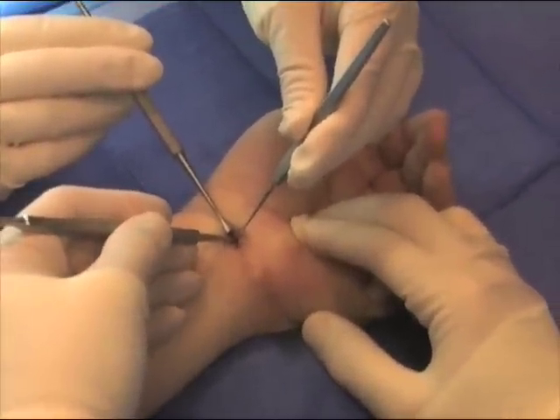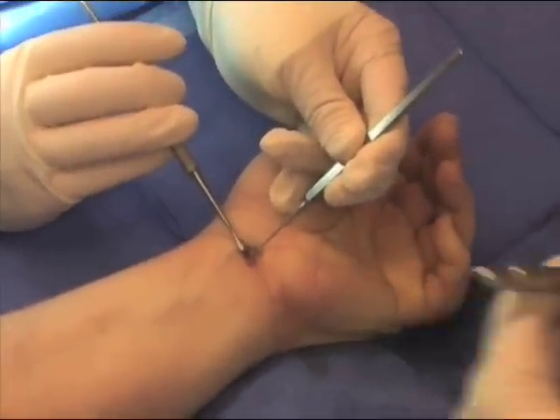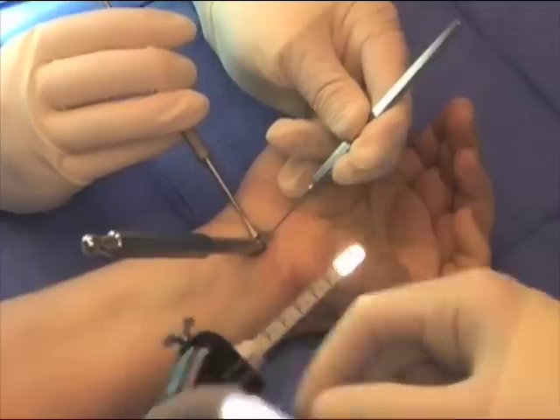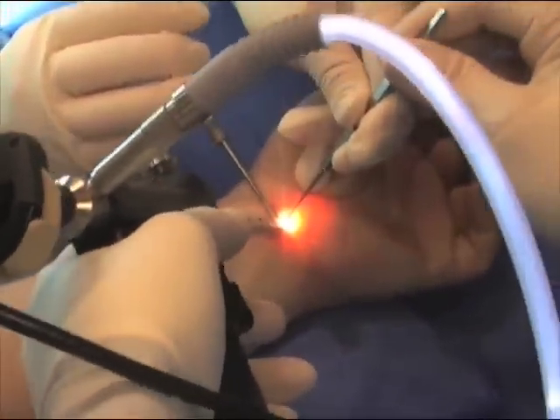Specialized instrumentation is used to separate any contents from underneath the transverse carpal ligament to allow access. This is a dilator instrument, which is used to provide a pathway for the endoscopic carpal tunnel instrumentation, shown here.